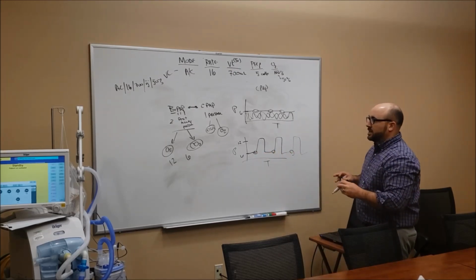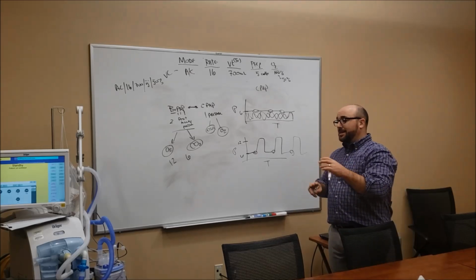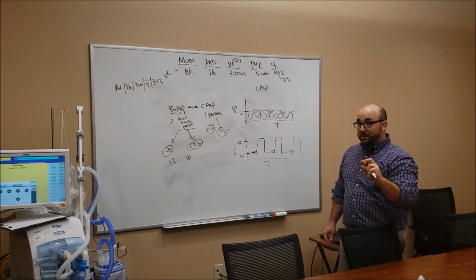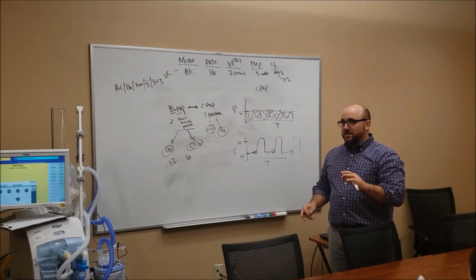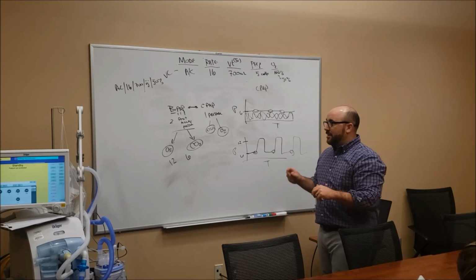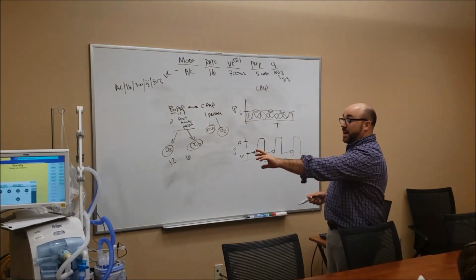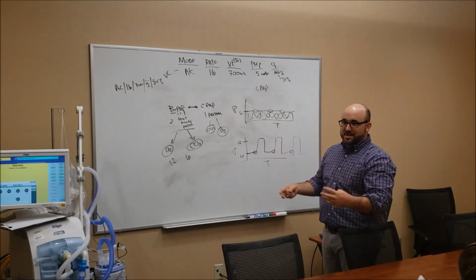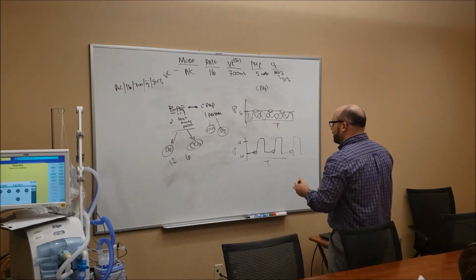So the best way to describe BiPAP is we're augmenting their spontaneous tidal volume. If Jamie has a patient with a respiratory rate of 6, BiPAP's not a good option for them, although sometimes it gets ordered because they have a respiratory rate problem. They need something that's going to affect their rate, which is a ventilator. This only augments their own spontaneous tidal volume, so long as your patient has a good respiratory rate, which a lot of our patients do.